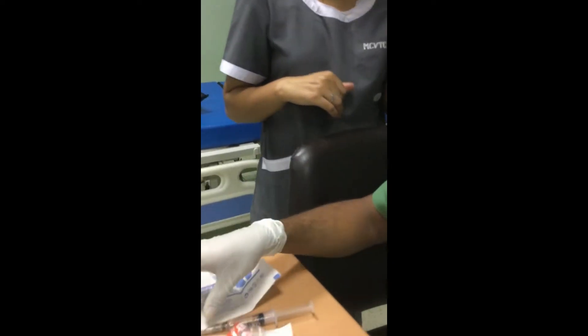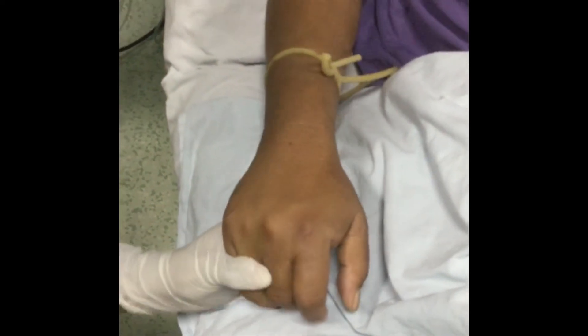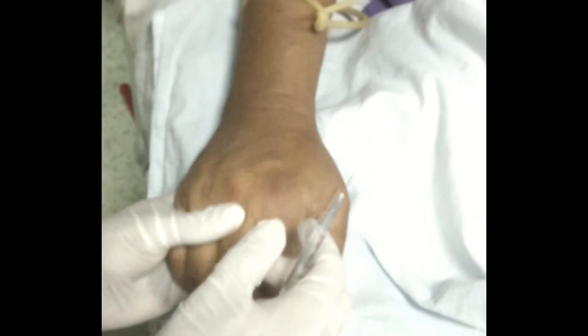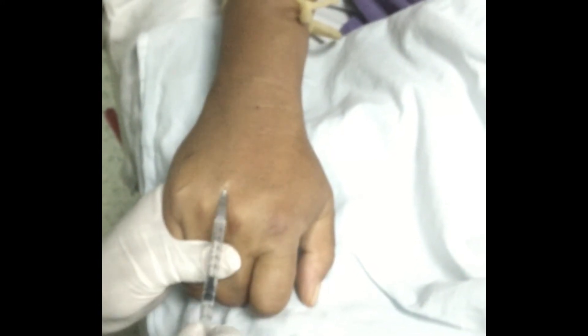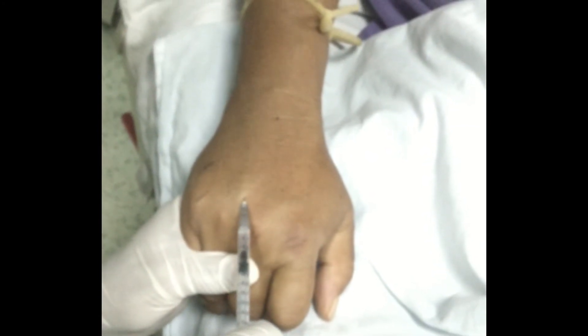Draw up lignocaine 0.12-0.2ml. Have the patient continue making a fist and opening and closing it several times, or if not possible, contraction and relaxation of the hand. Allow the vein to distend and become round. Measure the size of the vein. If needed, lignocaine 1% 0.12-0.2ml is injected locally at the site.